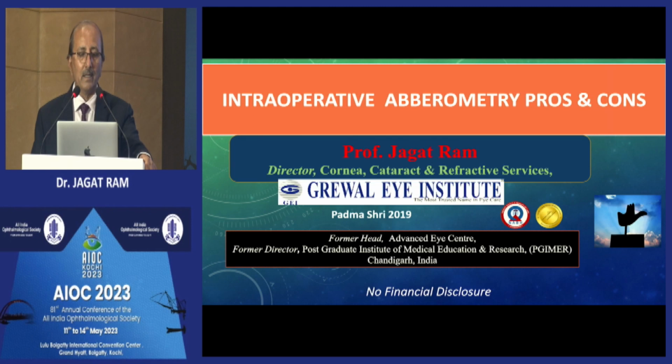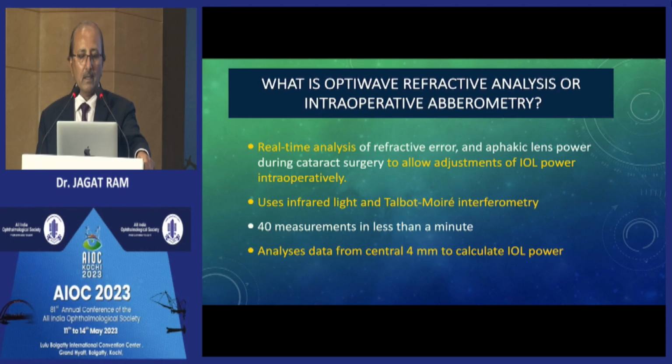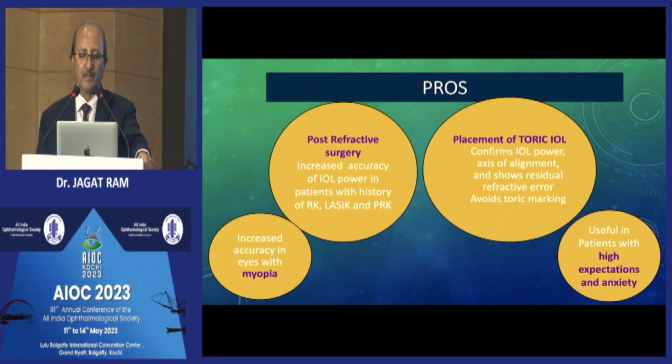Thank you, Dr. Shri Ganesh, for giving me this opportunity. I will be speaking on intraoperative aberrometry pros and cons. Real-time analysis allows adjustment of IOL power intraoperatively, and we use infrared light and interferometry. Analysis of the data from the central 4 millimeters calculates the IOL power.